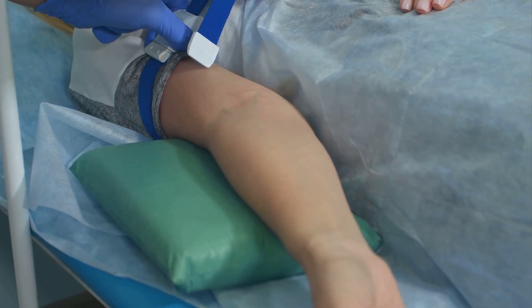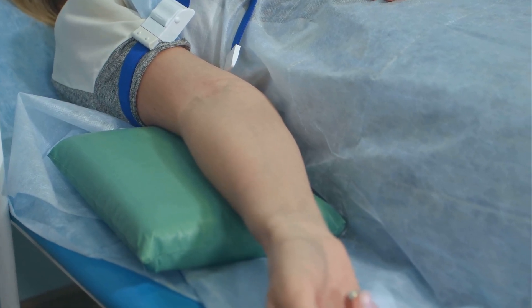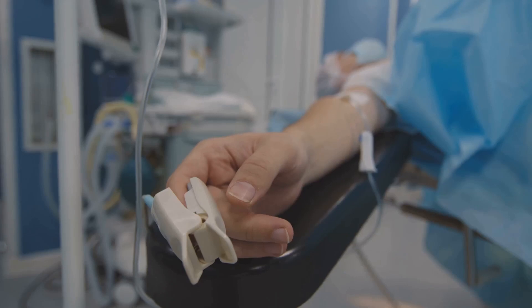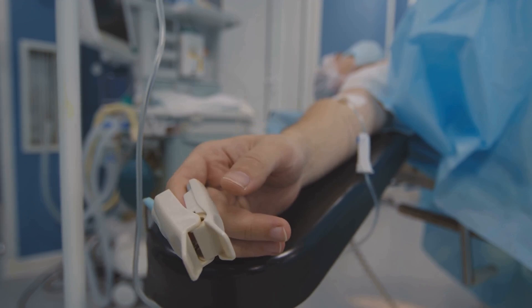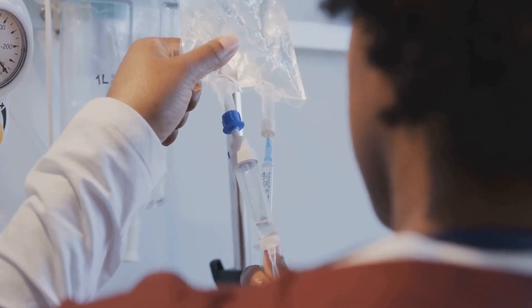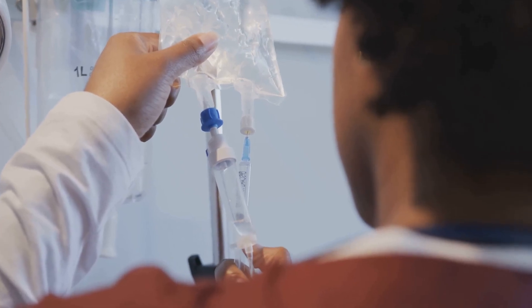Phlebitis is an inflammation of the vein, often caused by irritation from the cannula or the infused medication. It can develop gradually or appear suddenly. The area will be red, tender and warm to the touch. Patients may also complain of pain or a burning sensation along the vein. Again, stop the infusion, remove the cannula, and apply a warm compress to soothe the area and promote healing.